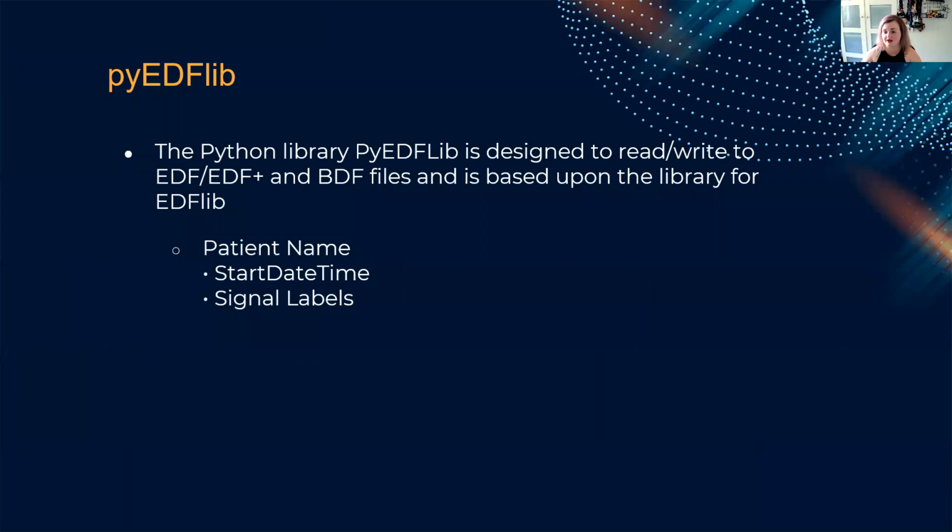One of the libraries that I used was py-edf-lib, which allowed me to read or even write to files if I wanted to. It gave me information about who the patient was, the start date time of the file, and what signal labels were recorded. So not quite a lot in terms of what I wanted to have.